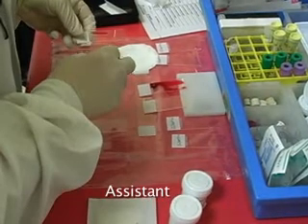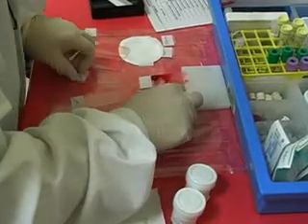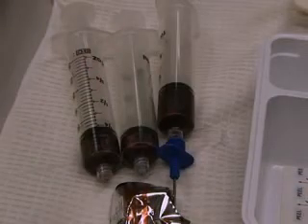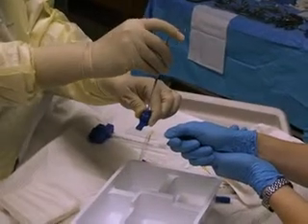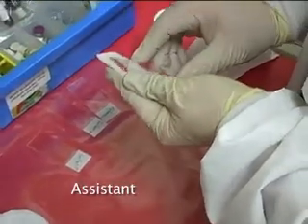A technician is often available to assist with preparation of the bone marrow aspirate and bone marrow biopsy. Aspirate smears may be prepared at the bedside from unheparinized bone marrow aspirate; this should be done quickly to avoid clotting of the specimen. Bone marrow aspirate may also be sent to the lab for further analysis in heparinized syringes. The core biopsy specimen should be collected onto sterile gauze or a slide and inspected for adequacy of marrow. The biopsy specimen should be at least 2 cm in length in an adult patient.